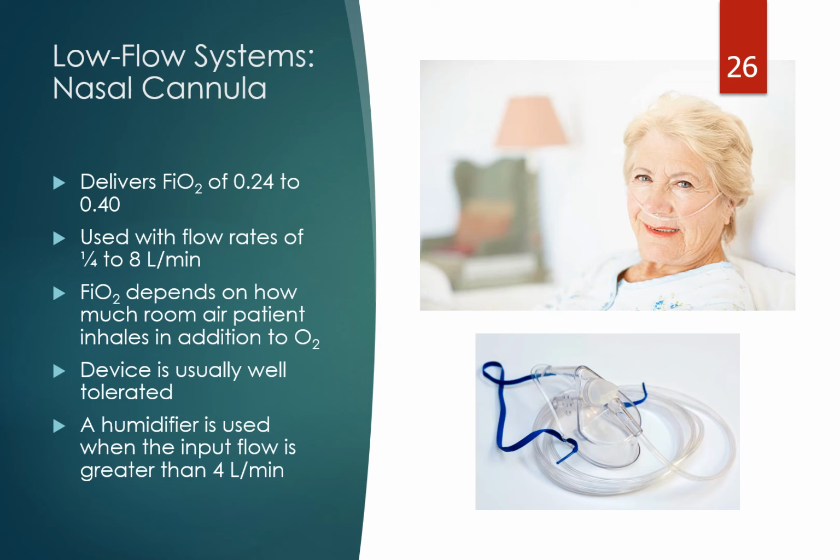The FiO2, what is actually being delivered to the patient, varies based upon entrainment of air that's in the room. So in other words, if you have a simple mask and the mask is loosely fitted, you're going to get a variable FiO2 delivery because of entrainment of air coming in from the room. Typically, these devices are well tolerated. The only thing I would say is that if you have a flow of greater than 4 liters per minute, you might want to offer some kind of humidification so it doesn't dry out the nares.